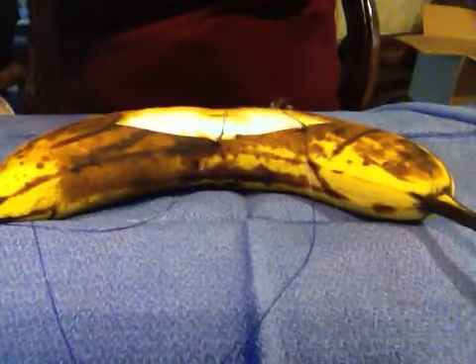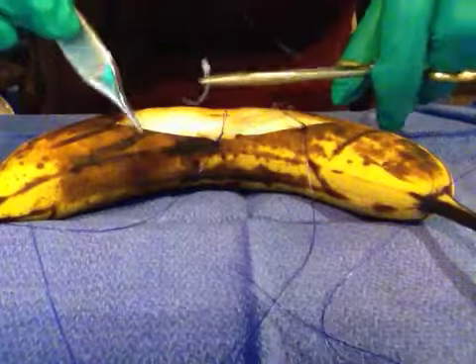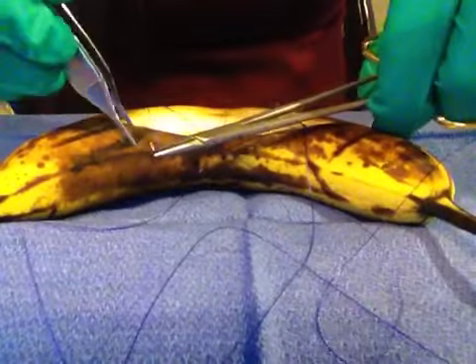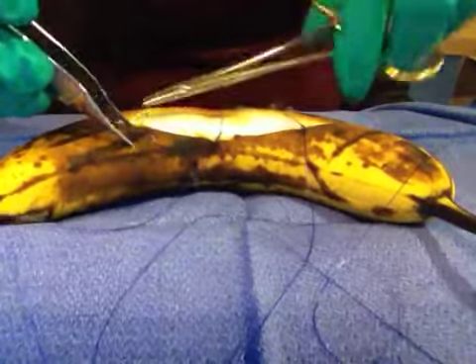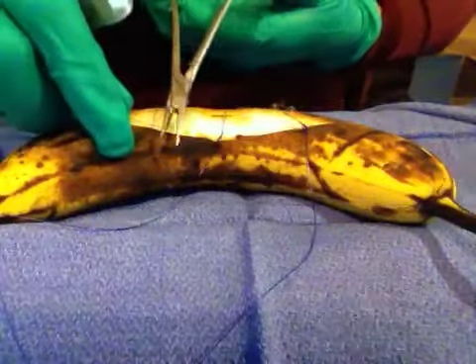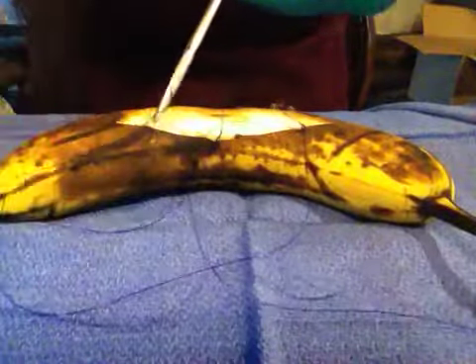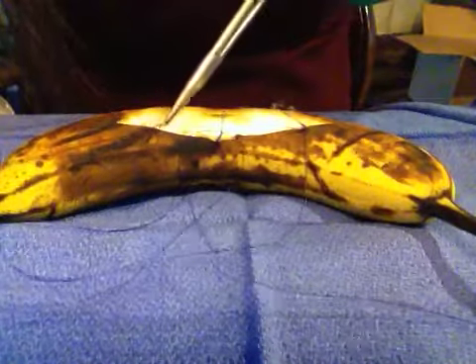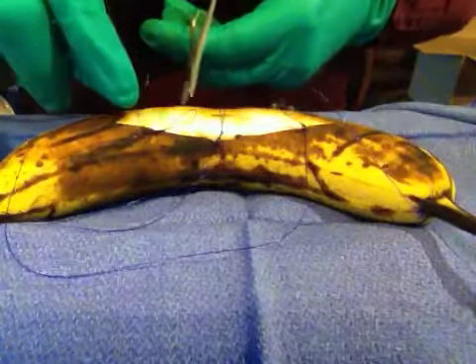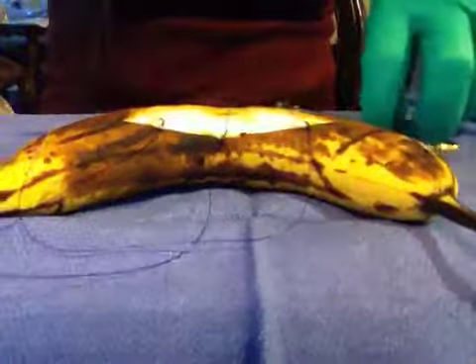Okay, so now I have two sutures on one side. I'm going to do one more, so I have a total of three sutures. I'm going to try to make all the sutures even, so when it comes down to tying them. One more. Okay, cut that. So I have three sutures on this side. Now, I will put three sutures right across.